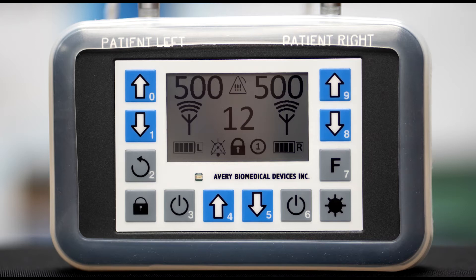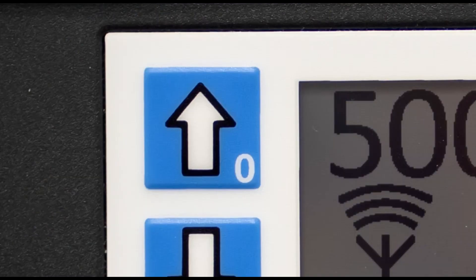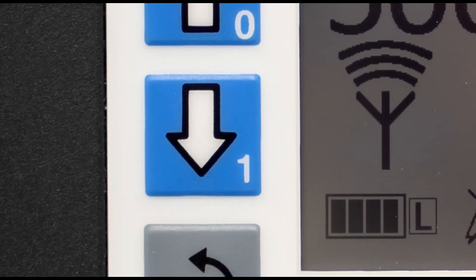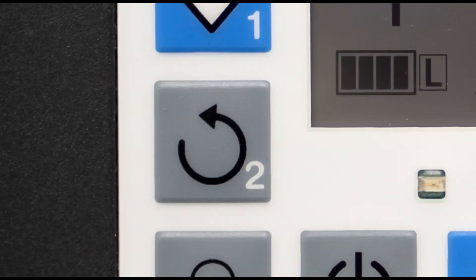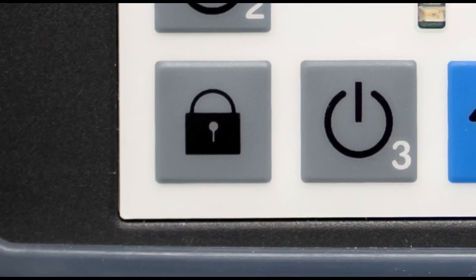The following are the keys. Key 0 increases the left side amplitude. Key 1 decreases the left side amplitude. Key 2 is for Avery Technician use only. The lock key locks and unlocks the keypad.